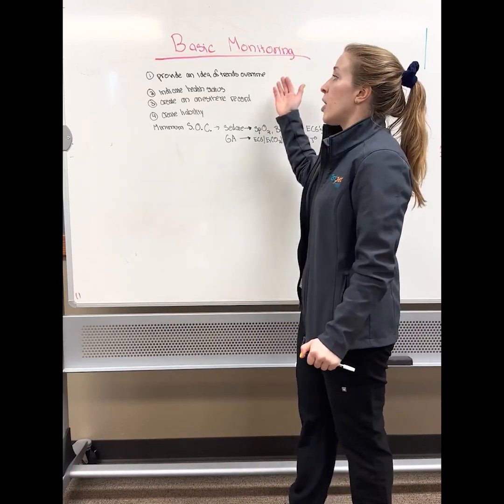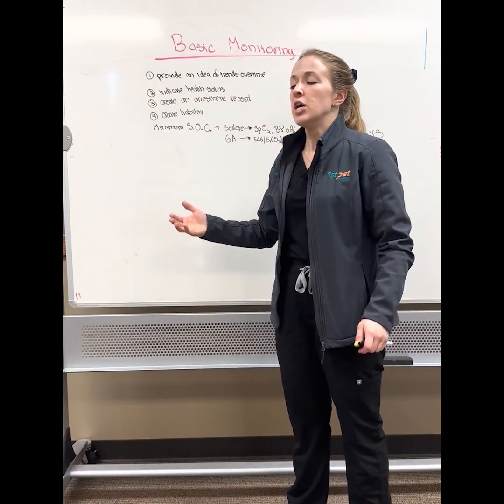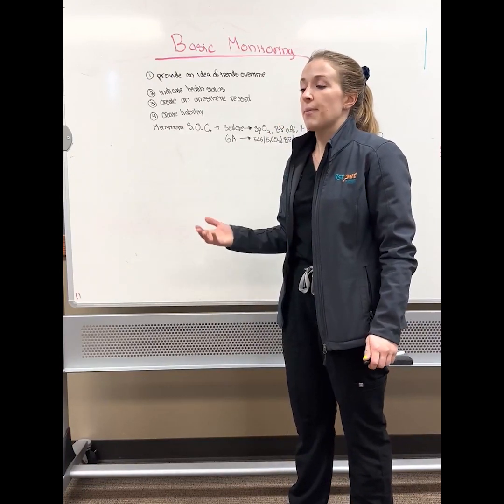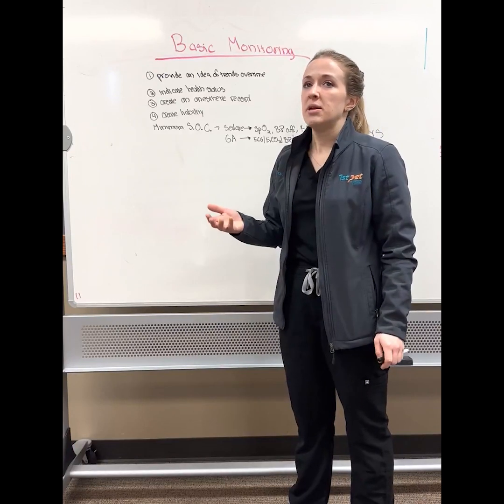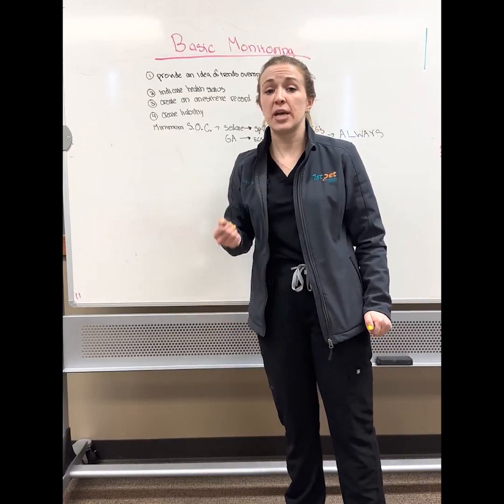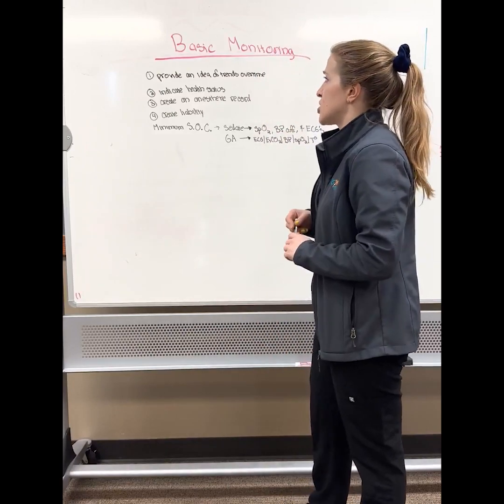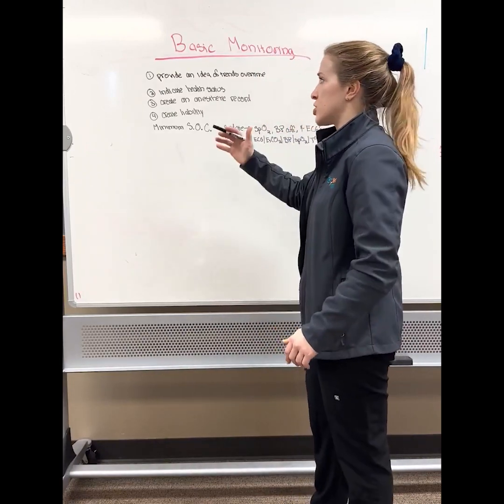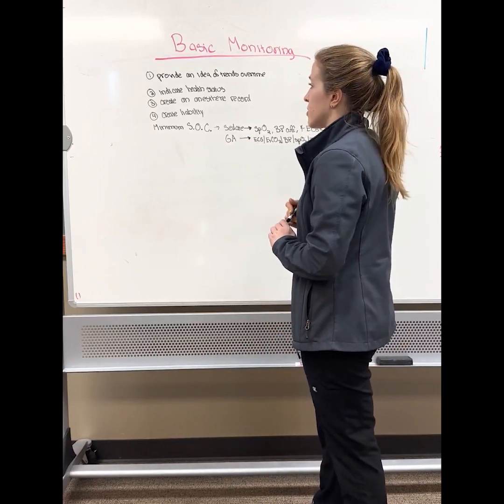By monitoring vitals such as blood pressure, heart rate, and respiratory rate, you're going to get an idea of what is happening over time, and that's going to tell you in a 15-minute period, in a 1-hour period, do I need to make some type of change, or can I keep going because this is working for me? So provide an idea of trends over time. It's not just one look, it's the whole thing. The job of the anesthetist is monitoring, so that's why it matters.